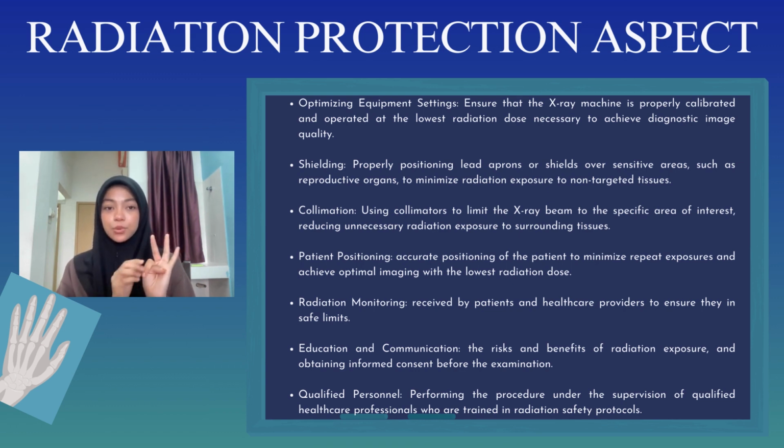Patient positioning: accurate positioning to minimize repeat exposure and achieve optimal imaging with the lowest radiation dose. Radiation monitoring: radiation received by the patient and the healthcare providers is monitored to ensure they are within safe limits. Education and communication: we as radiographers should inform the patient about the risk and benefit of radiation exposure and obtain informed consent before the examination. Last but not least is qualified personnel: performing the procedure under the supervision of qualified healthcare professionals who are trained in radiation safety protocols.